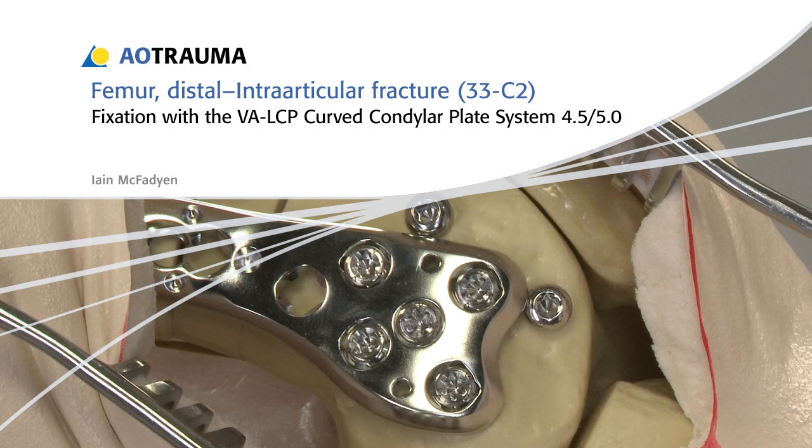In this presentation, an intraarticular fracture of the femur, a 3-3-C2 fracture, will be treated with the variable angle LCP curved condylar plate system 4.5/5.0.